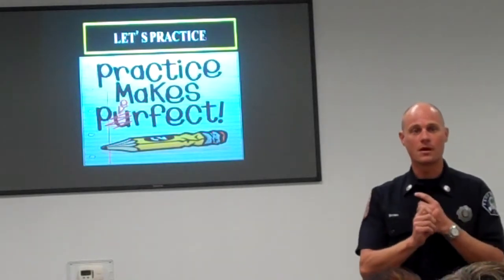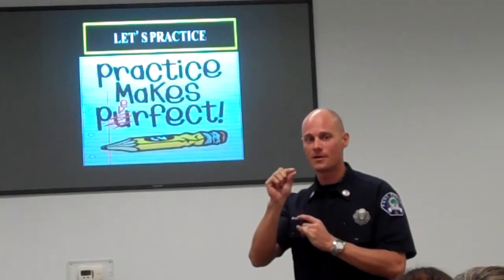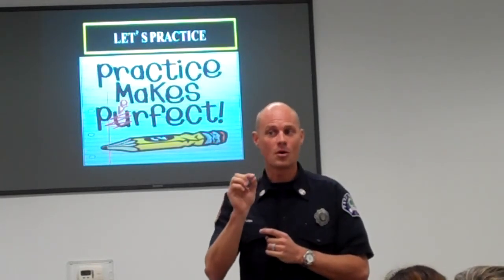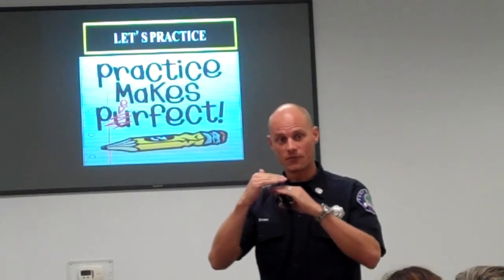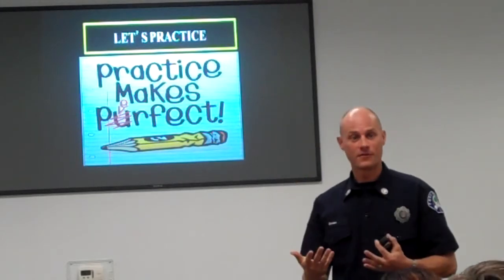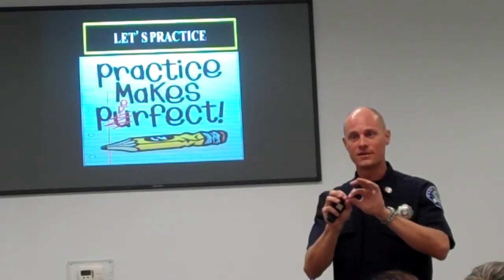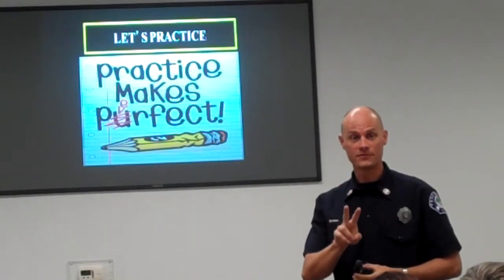For 12 leads, for ST elevation, we're looking for elevation of, you guys remember how many millimeters? How many small boxes of elevation for the ST segment? It's one small box or 1 millimeter, okay, or more. So if we get one small box or more of elevation, that's indicative of ST elevation, okay? How many contiguous leads do we want to see ST elevation in to make sure that it's actually a heart attack? Minimum of 2, right?